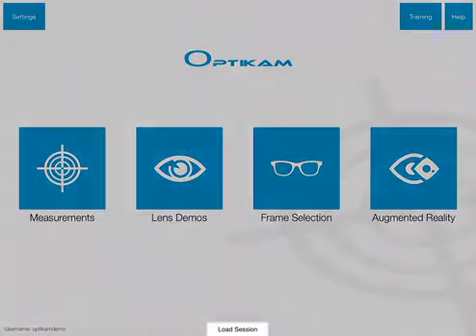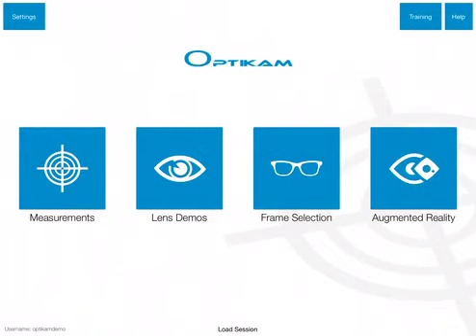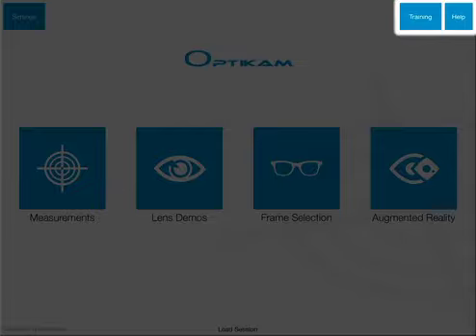Saved sessions can be retrieved using the Load Session button. Training material and 3D measurement training scenarios are available in the Training panel.